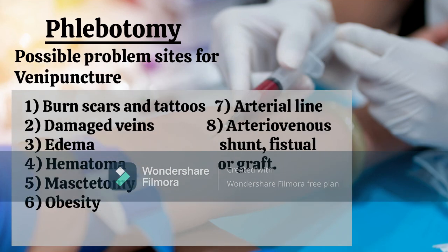Possible problem sites for venipuncture. 1. Burn scars and tattoos. 2. Damaged veins. 3. Edema. 4. Hematoma. 5. Mastectomy. 6. Obesity. 7. Arterial line. 8. Arteriovenous shunt, fistula or graft.